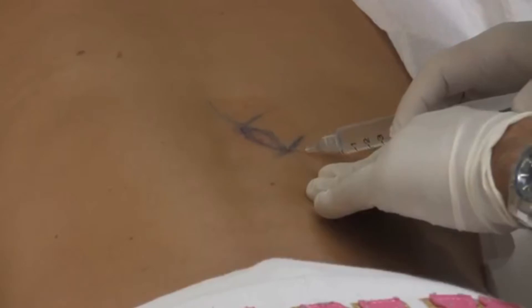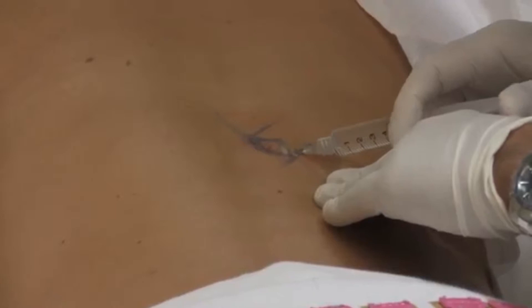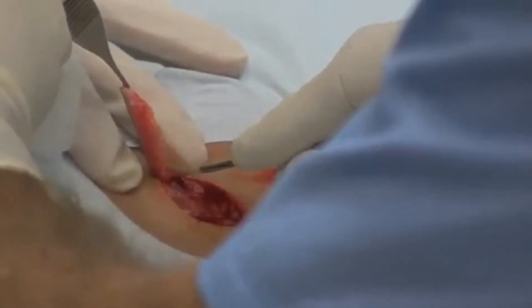The surgery site has been properly identified, prepped with an antiseptic antimicrobial skin cleanser, and local anesthesia has been administered. The surgery margins are marked, cutting into the dermis, and the specimen is removed.